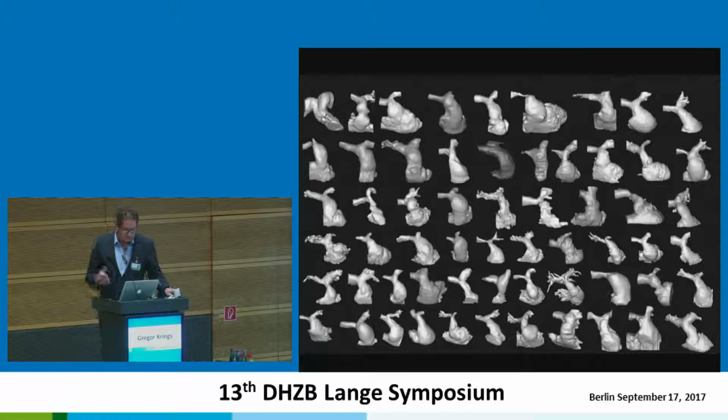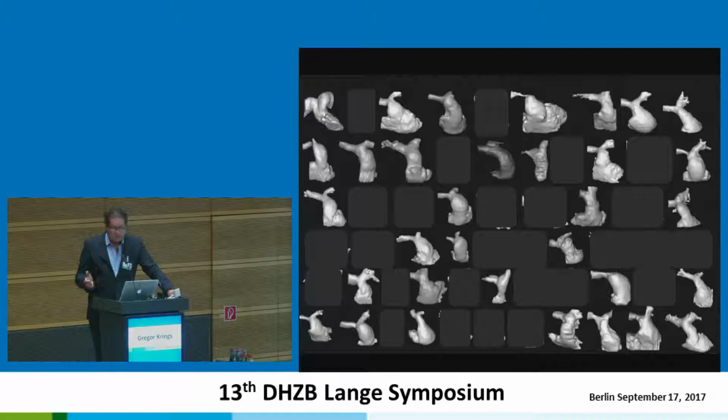If we take a look at the RVOT morphology, which is shown in the paper from Schievano, then we know that we have this huge variety of RVOT morphology. And if we take away those which would be primarily suitable for Melody or Sapien valves, the smaller valves, then these bigger ones would still be there. And as Lee said, probably 3/4 of the patients nowadays would have to be sent to surgery and would not be suitable for a percutaneous valve because the anatomy of the MPA would be too large and not suitable.